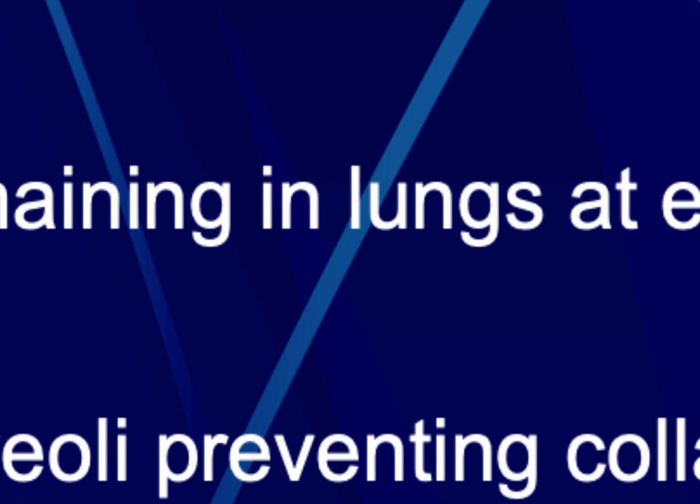And I think if you put it that way to your patient, it does put them at ease. I mean, the machine is loud, right? That mask is cumbersome, I guess, is the best way to put it. It can get them anxious, right? And we want to try to keep them from becoming more anxious by not explaining this procedure and just trying to slap this mask on their face and forcefully holding it down against their face while they try to breathe in.